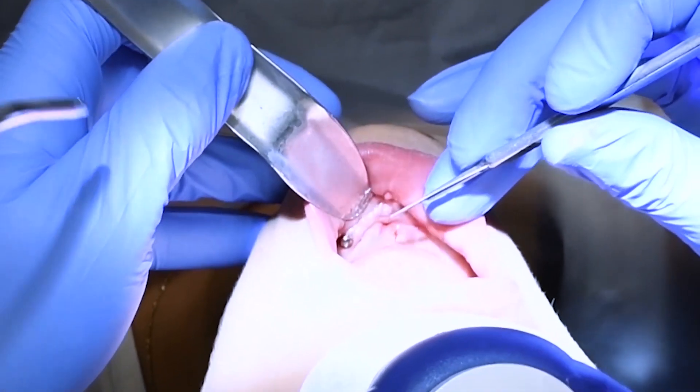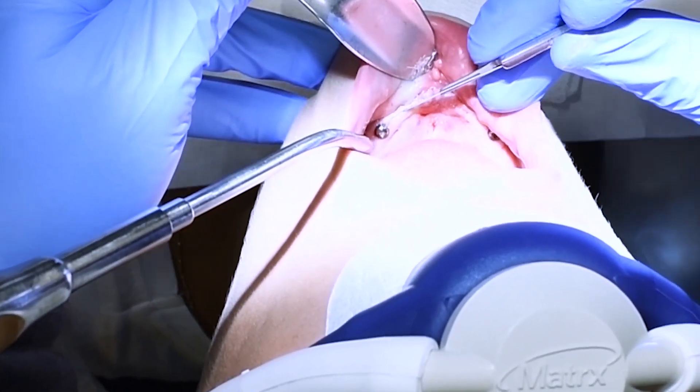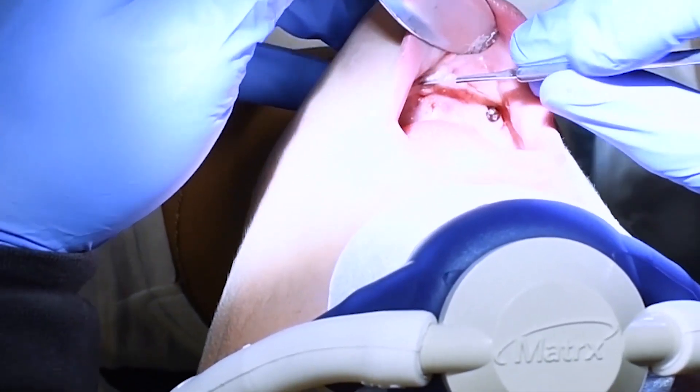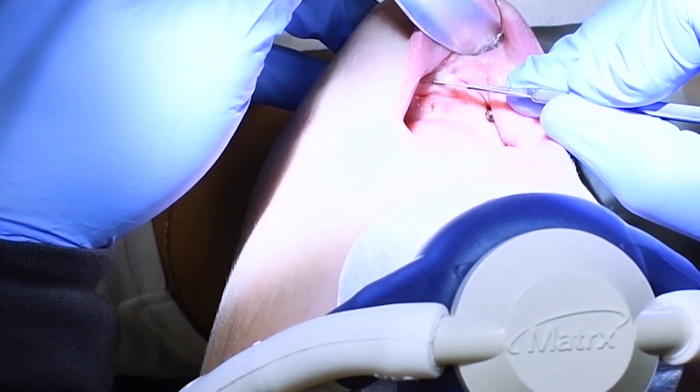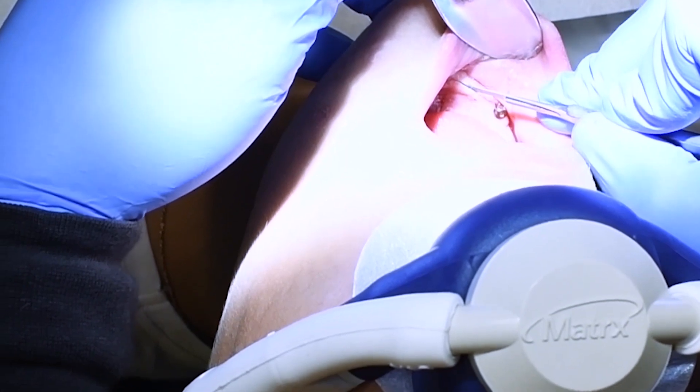Alright guys, thanks for tuning in. This is an interesting case where I previously placed one implant in the anterior and it failed, so I took that implant out, grafted the area, let it heal, and now I'm coming back.